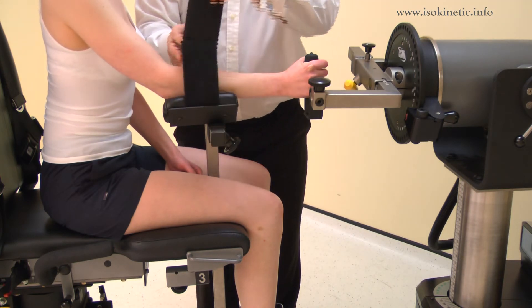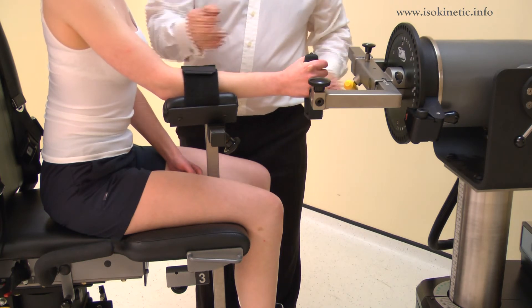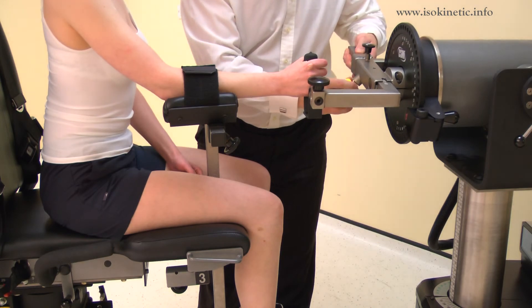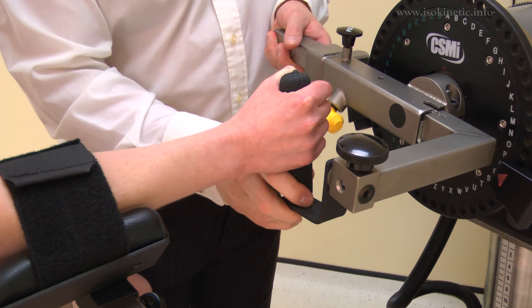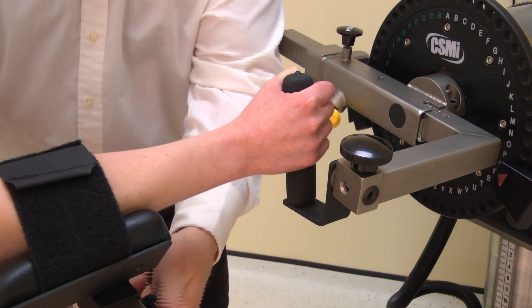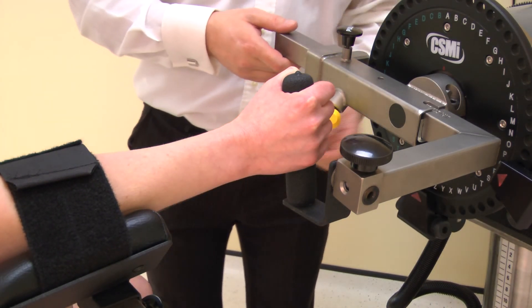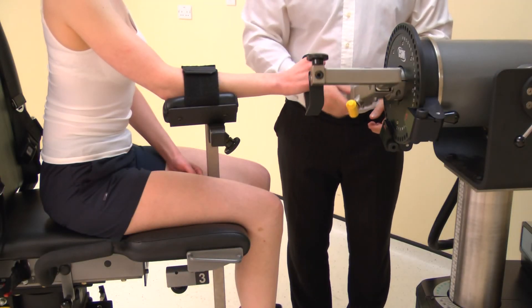Attach the forearm strap. Now adjust the length of the wrist shoulder adapter to ensure the center of the forearm is aligned with the black dot on the input adapter. The axis of rotation is through the center of the forearm at the fourth finger level. Adjust the lateral position of the forearm stabilizer to ensure there is no torsion in the forearm. The test is ready to begin.